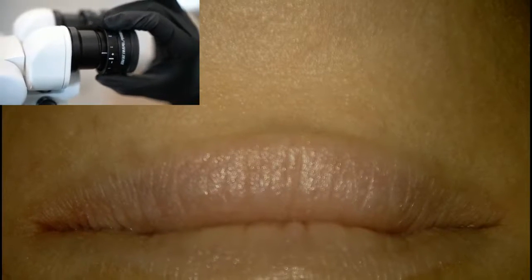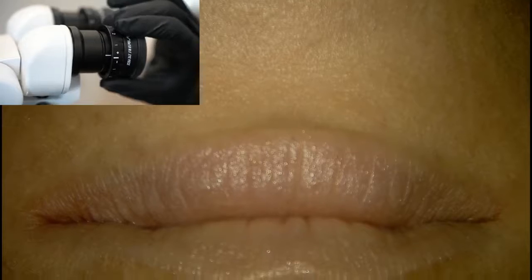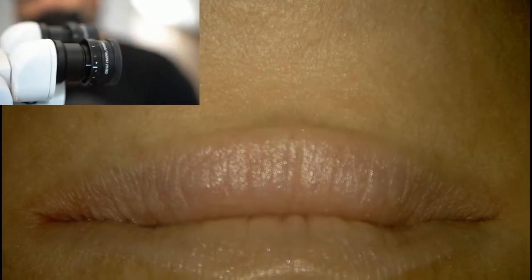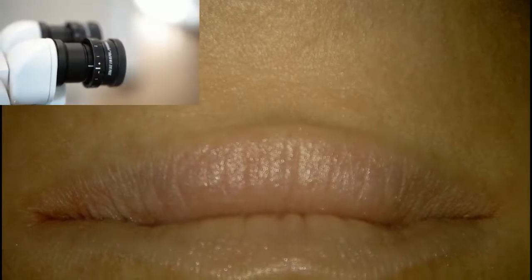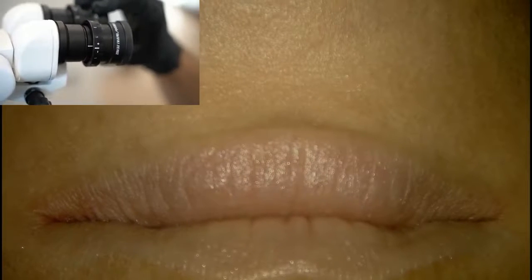This can give you your plus or your minus correction. My eyes, I don't have any correction going on, so I will leave it on neutral, meaning there's no correction. The other thing is these eyepieces, in this brand, can come out.